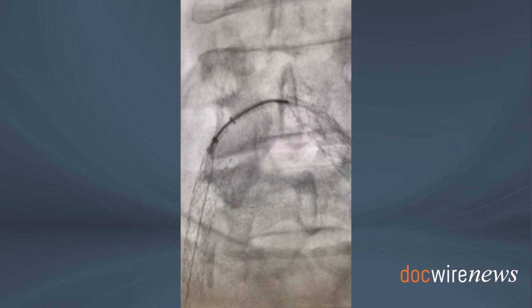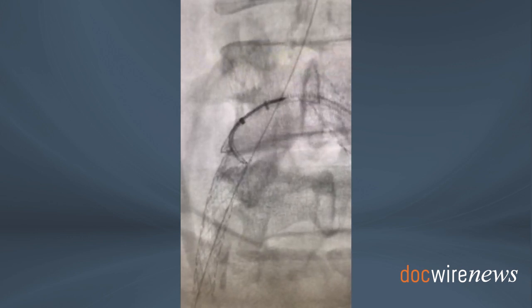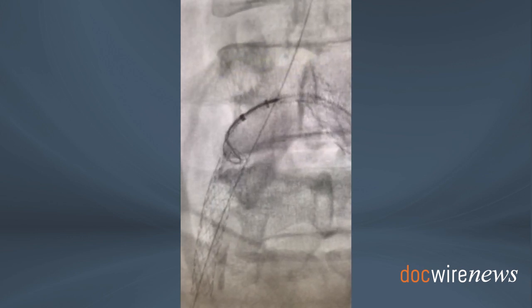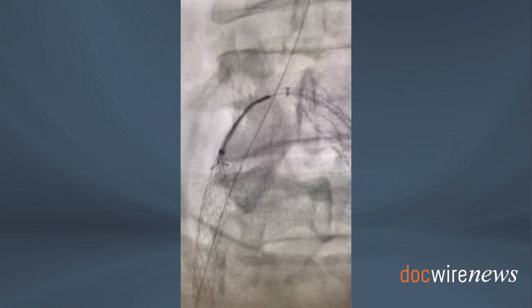in a centered fashion. The wire disengages the snare, and this was done while the snare was closed to minimize entanglement. And this position of the sheath allowed us to center the snare, then to rotate it in a way that allowed us to grab the edge of the proximal component of the covered stent.